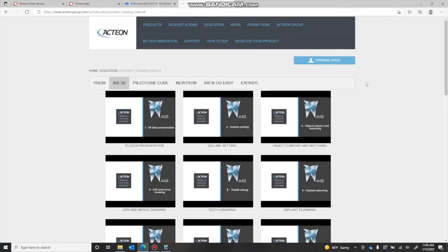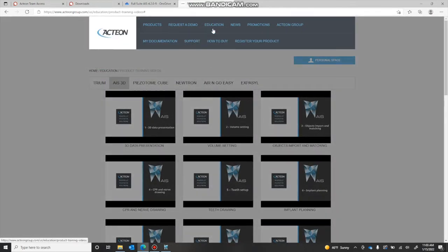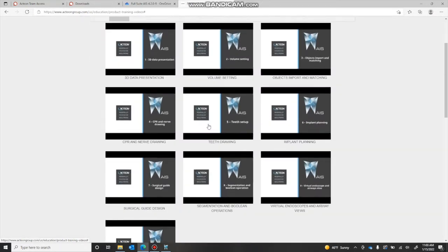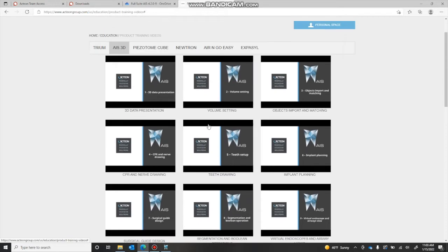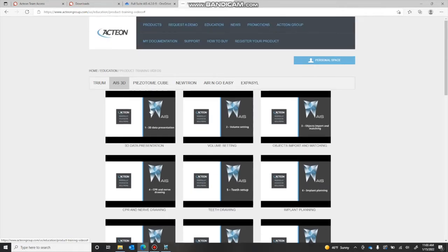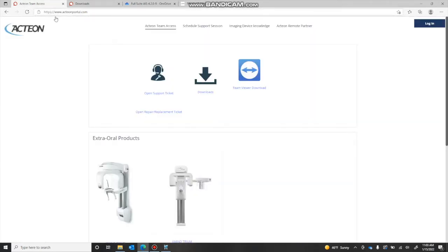Today we're going to go over some AIS and AIS 3D training. If you go to our website, acteongroup.com, you can go to the Education tab, down to Product Training Videos, and then AIS 3D, and you're going to find some additional videos produced by Acteon that also cover the 3D training.